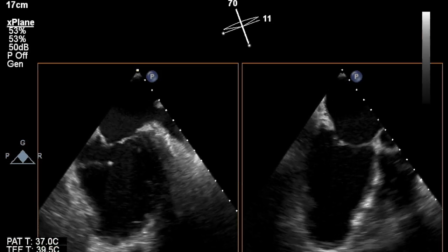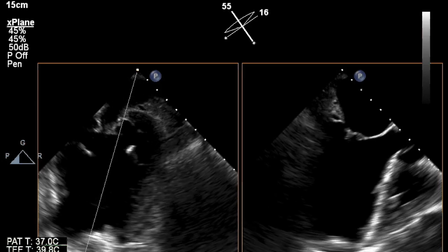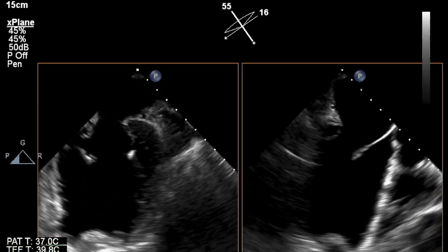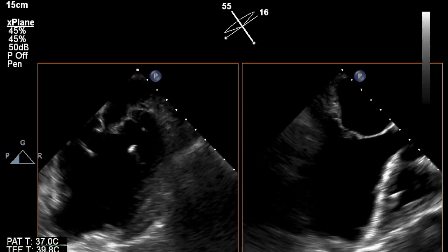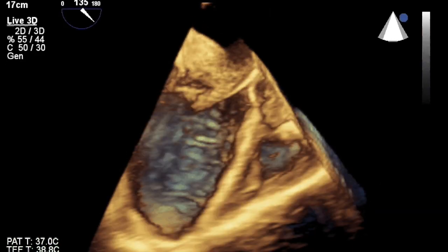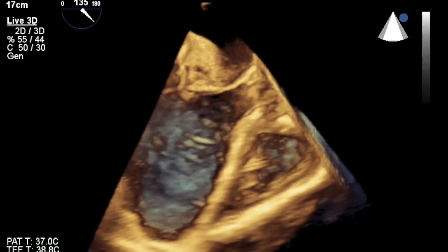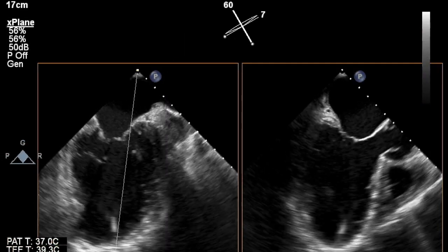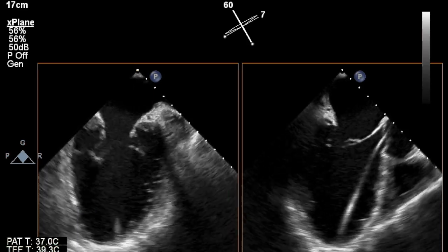The apical axis is confirmed at the surface of the pericardium. You can see the dimpling or the indentation. The axis apex is the apex that is in the center of the mitral annulus. This may not be the true apex. In this case, the axis site is lateral and anterior. The indentation of the apex was clearly visualized on 2D and 3D.